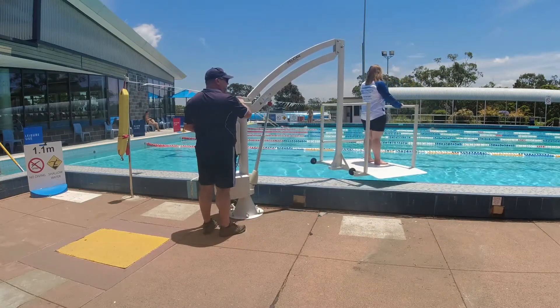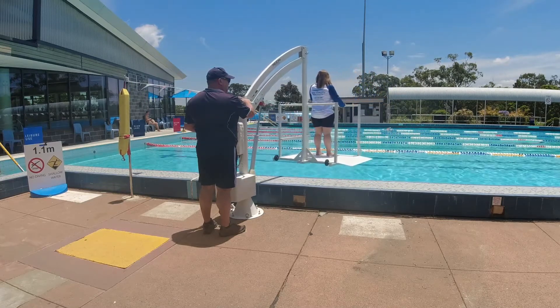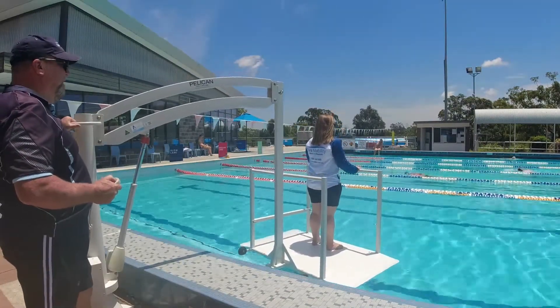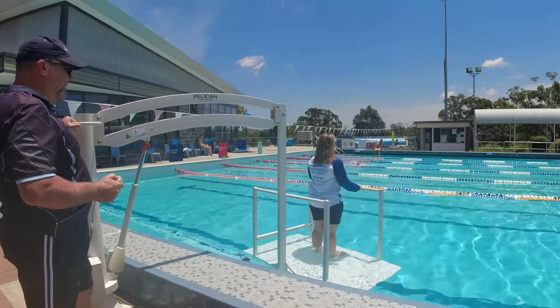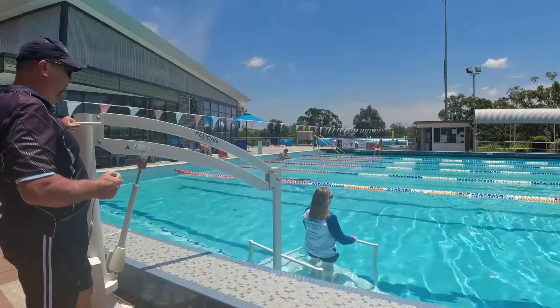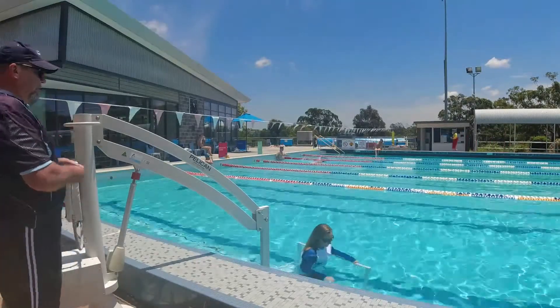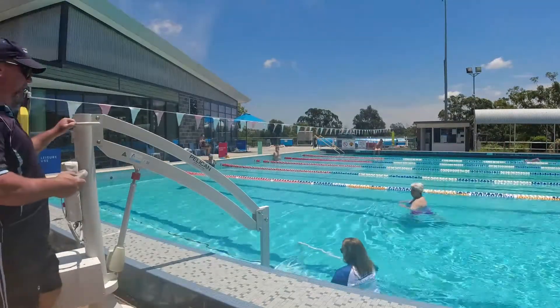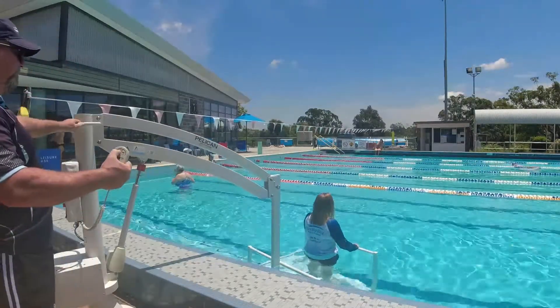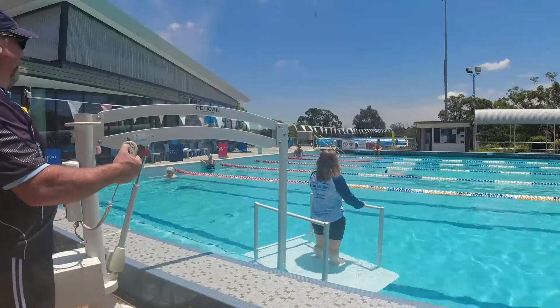It is important for the operator and user to communicate that all is okay and ready to go. Note that this video section has been sped up by two times for this training session only. It's normal for the platform to be lowered to the pool floor; however, if used in a deeper pool this isn't essential as a person can swim off instead of walking and return accordingly. For safety reasons it is also normal for the platform to be removed from the pool and positioned back on the pool deck after lowering the person in.